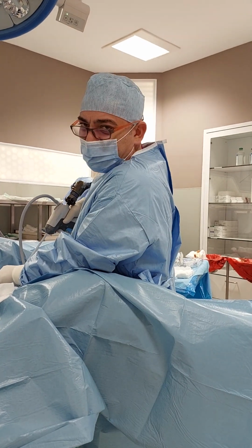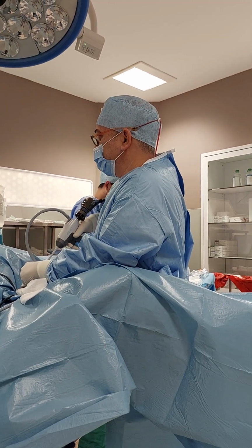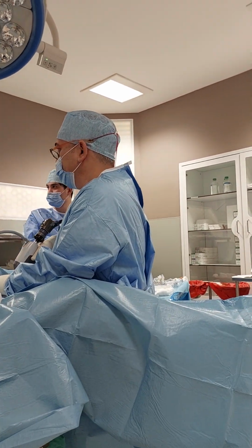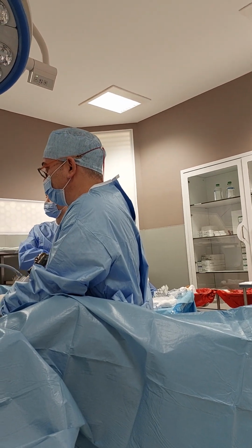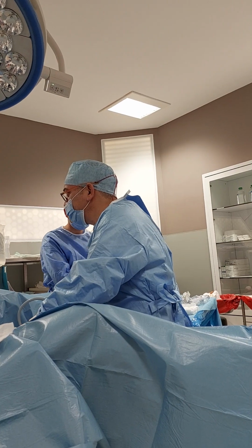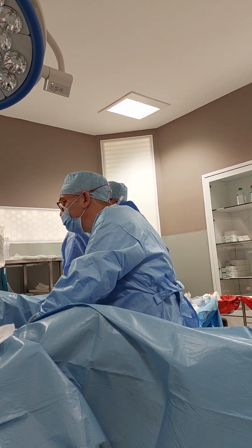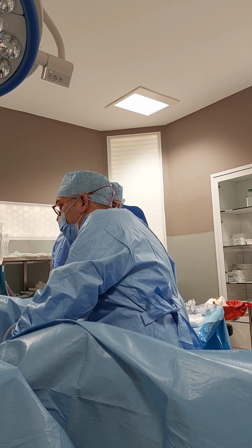Now, our patient is coming from Canada. He is coming here for a Rezum procedure. I think he is young and his prostate is not too big. So there are two options: he may have some prostatitis or he may have bladder neck stricture. So I'm trying to go in.